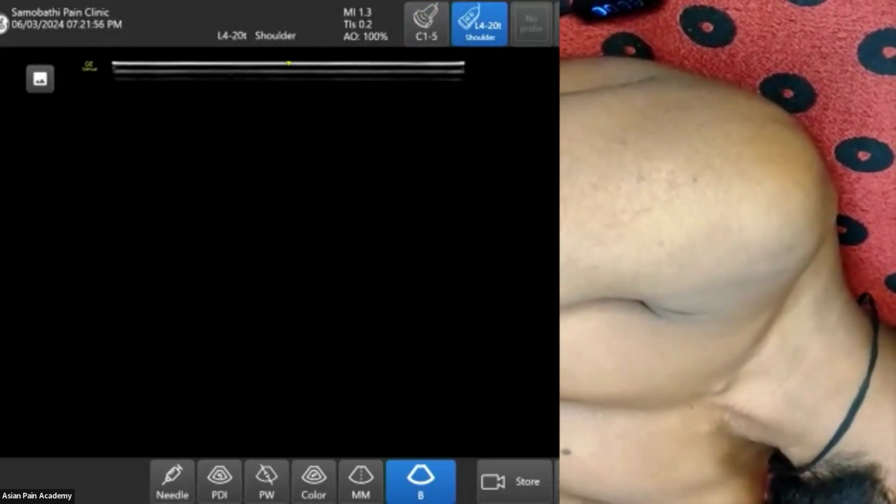So I think you can see the, no, loosen it, yes, yes, yes. You can see the neck part.